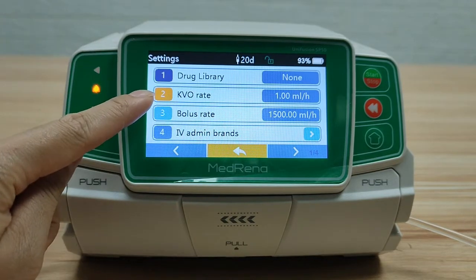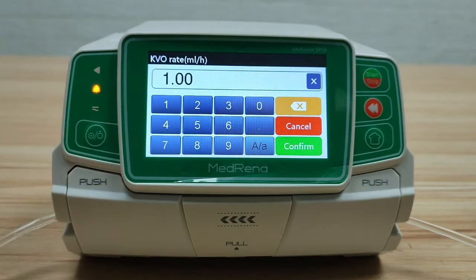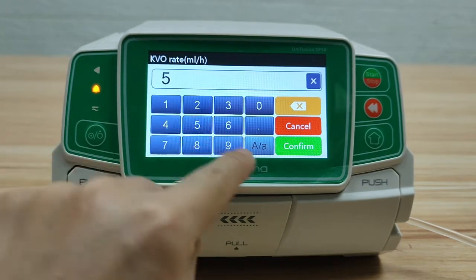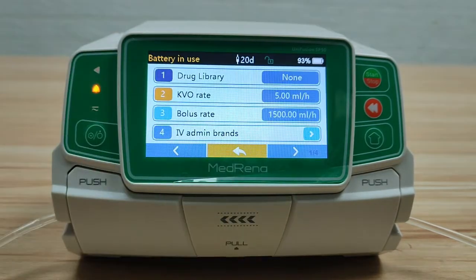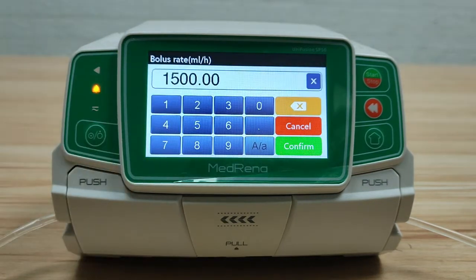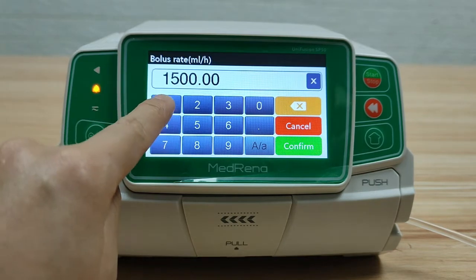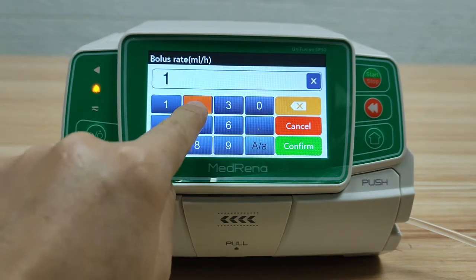The second setting is KVO rate. We can set the rate from 0.1 to 5 ml per hour. Next is bolus rate. The default bolus rate is the largest flow rate, 1500 ml per hour. You can set another bolus rate as needed — for example, 1200 ml per hour.